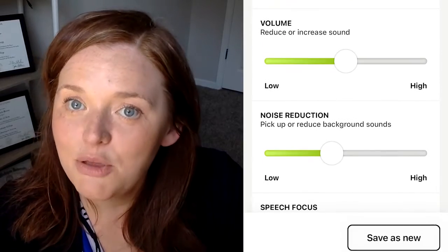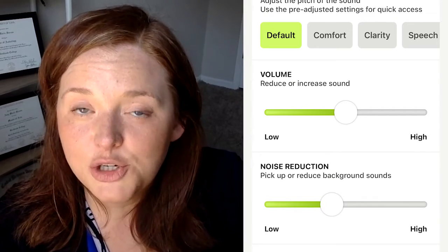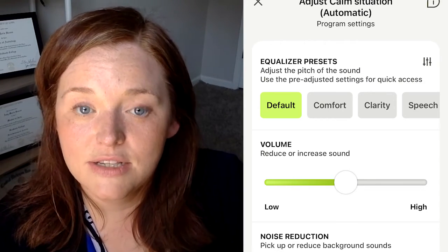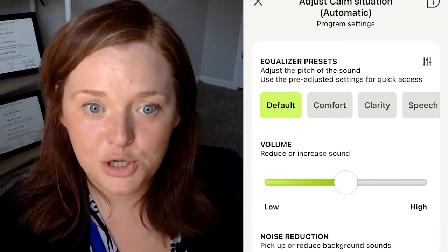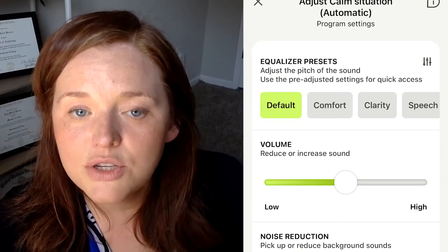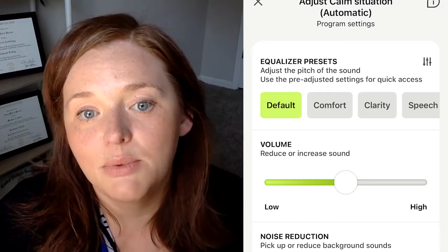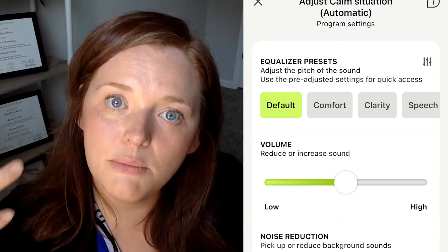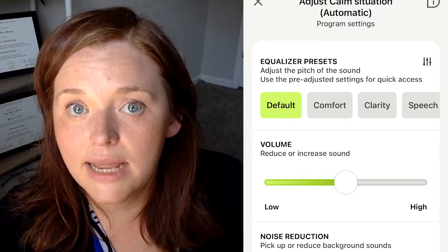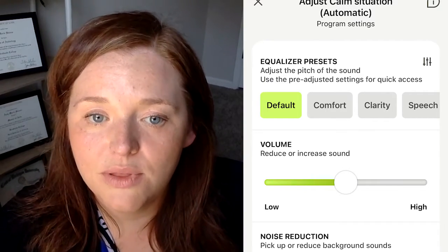After that, pairing is complete and now in the app you can change the volume and make other adjustments. One of the nicest features is your ability to customize settings to your preferences. You can do this in the custom section where you can adjust the volume low or high, change the noise reduction in the background. They give you defaults — you can select 'Comfort' if it's too loud, or 'Clarity' if you want more speech clarity. If you like a particular setting you've made, you can save it and give it a name so you can access it in the future.